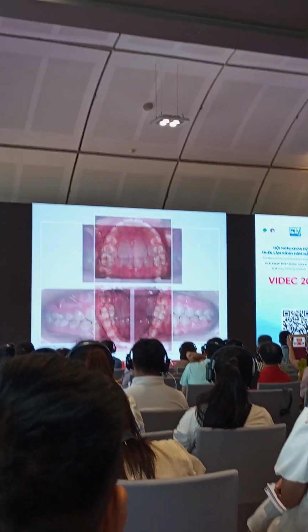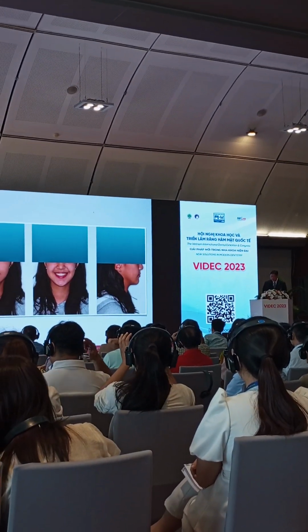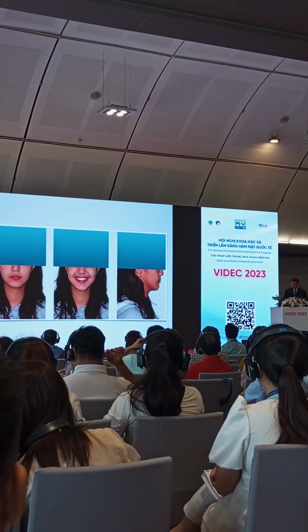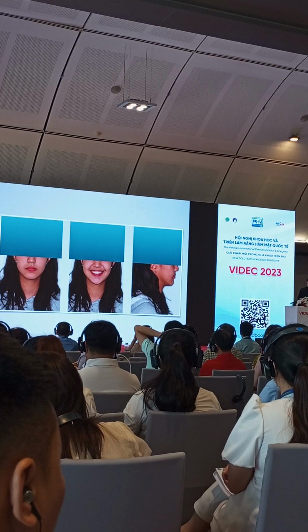So this is the occlusal view, and then this is the patient now. So she's a very beautiful girl, baby. Profile is very nice, because we did not do anything. And in the first place, her profile is already good before we started.